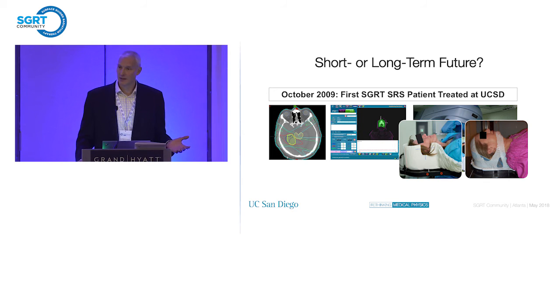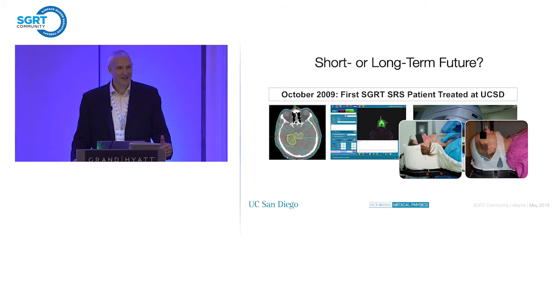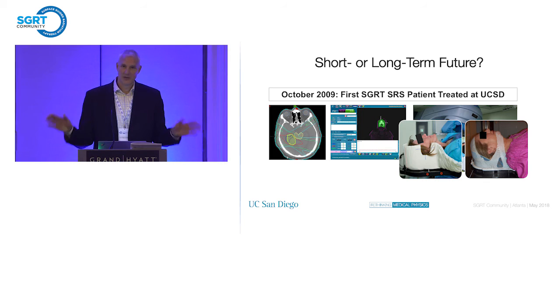You know what, at least our viewpoint, my viewpoint, I won't speak for Grace and Matt, you can see it differently. If you're using surface-guided radiation therapy and you're worried about rigid immobilization, you're missing the point. It's not about immobilization any longer. It's about patient comfort, it's about efficient treatment, and it's about monitoring the patient in real time so that if they move, you stop the beam. It's a whole different mindset, right?